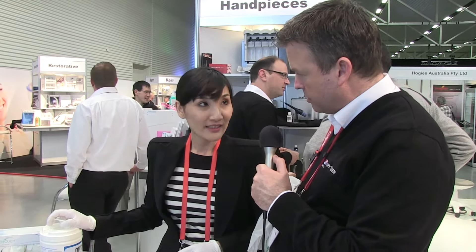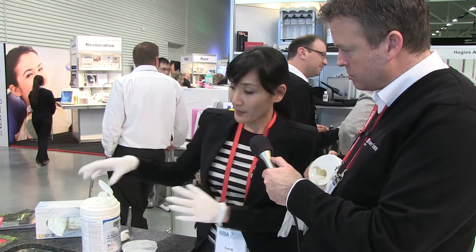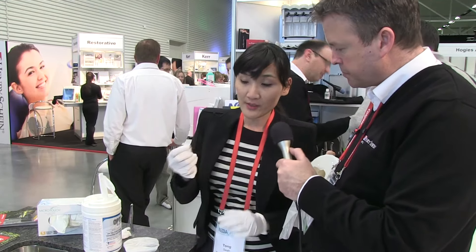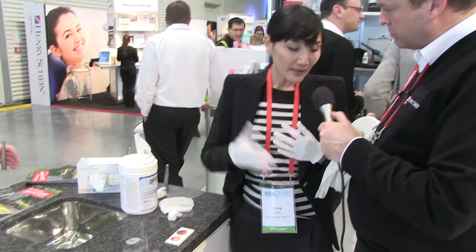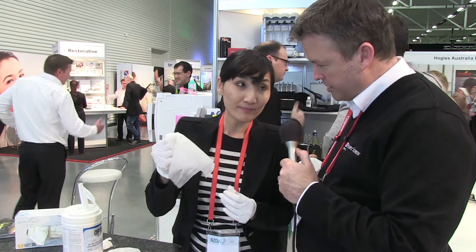So this is normally a two-step process? Yes, but with Optin it's a one-step product because it cleans as well as disinfects. The difference also is it holds a lot of liquid — look at the amount of liquid on this wipe — whereas a typical alcohol wipe is very dry.